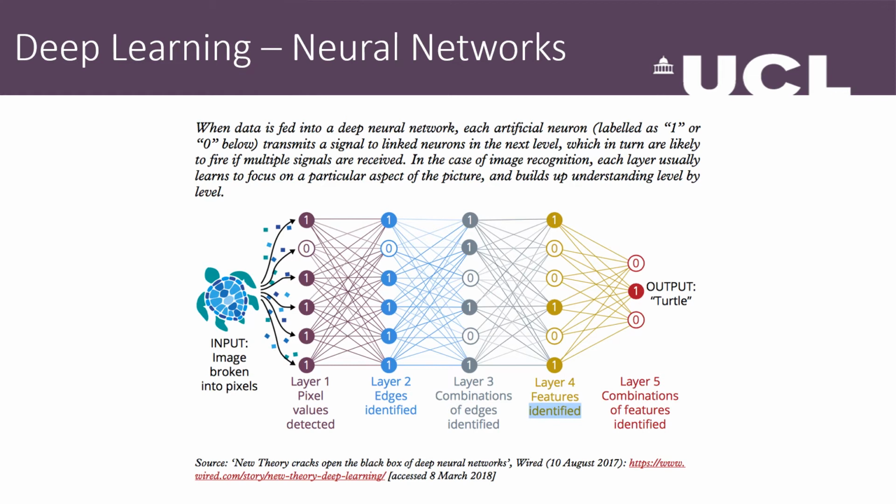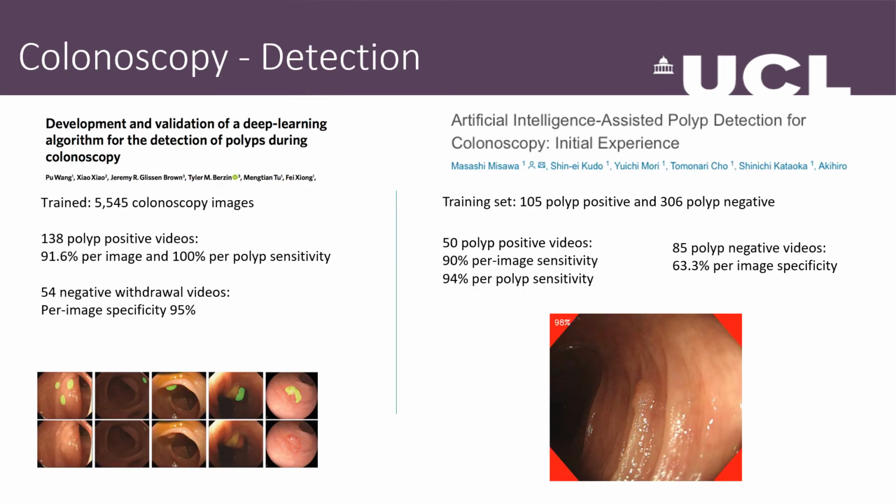But going back to my earlier slides, where I said we're taking this image, so we've got an input. We are then looking at various layers within that image, various data points within it. How these deep neural networks work is that they look at layer upon layer upon layer, picking out important information that we can't see as a human being, and then they recreate an output. So eventually you can make sense of that wealthy data that you get from the video or photograph.